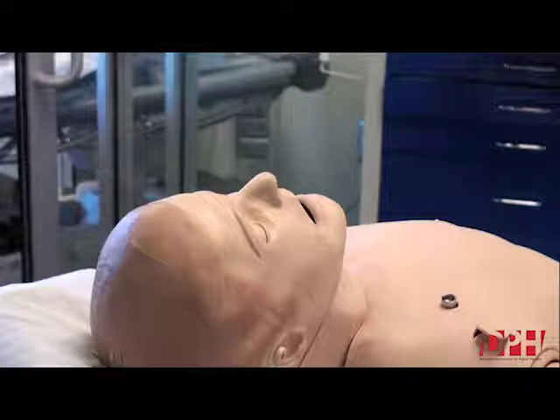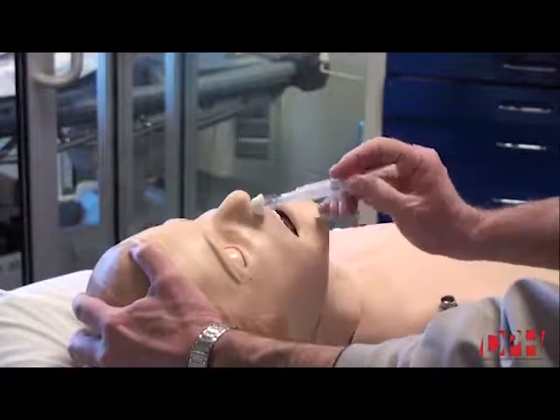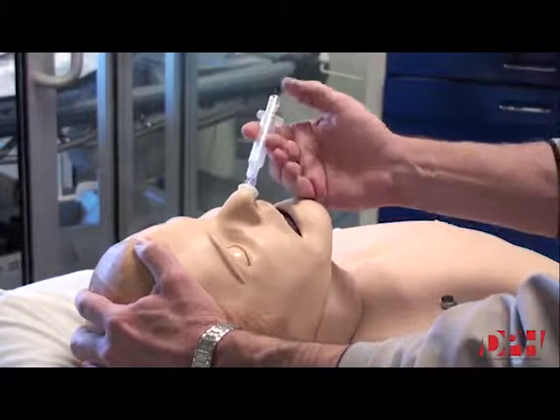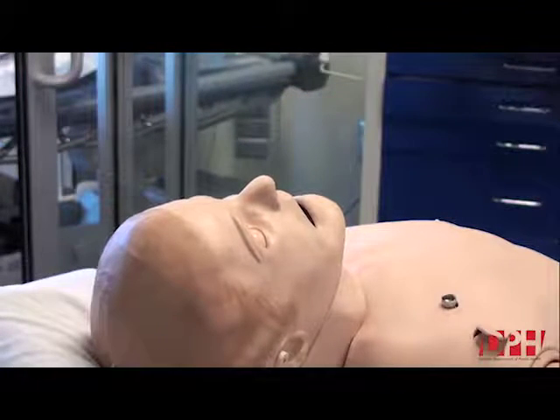Now you're ready to administer the naloxone. Gently tilt the head back, place the cone in one nostril, administer half of the medication into one nostril, then administer the other half into the other nostril. Repeat in two to five minutes if the person doesn't improve.